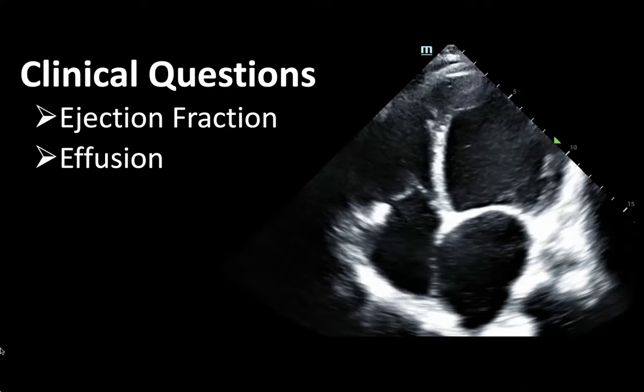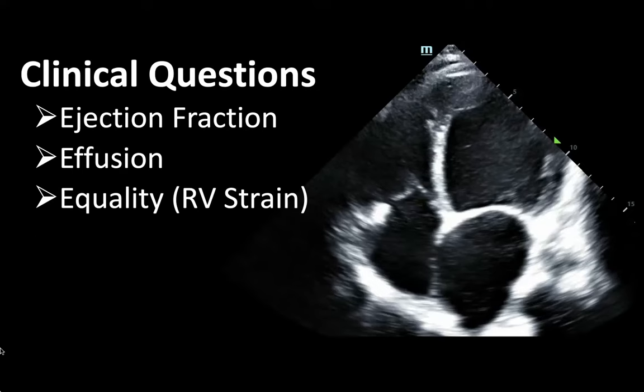Second, we look for effusion — namely, is there pericardial effusion or fluid around the heart? Thirdly, we assess for equality. We look at the difference between the right and left ventricle, which could be an indicator of right heart strain.